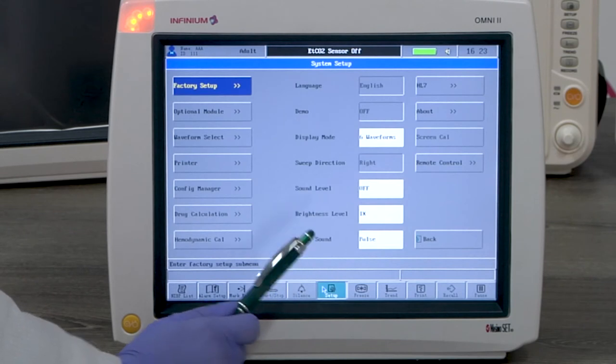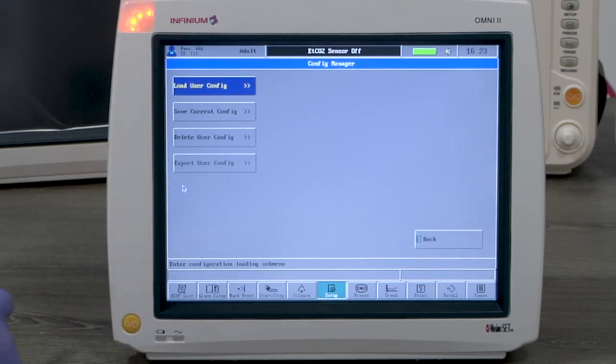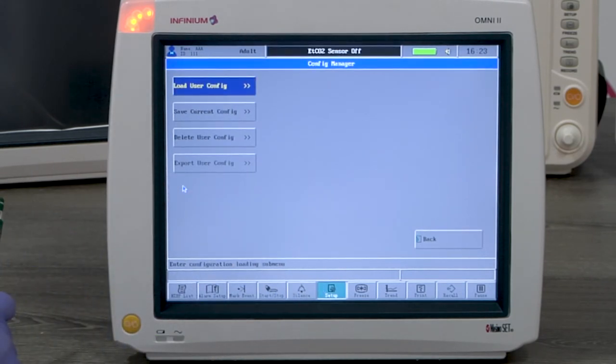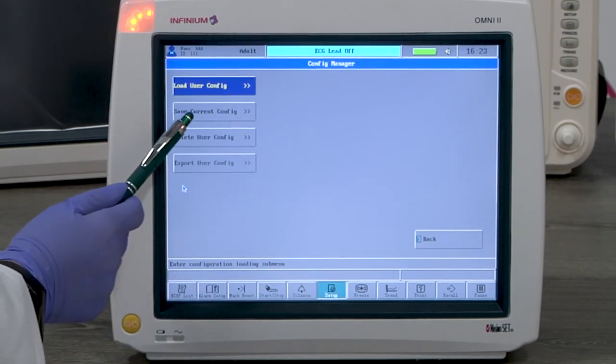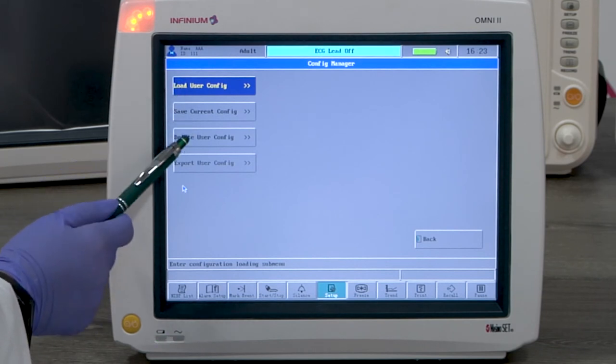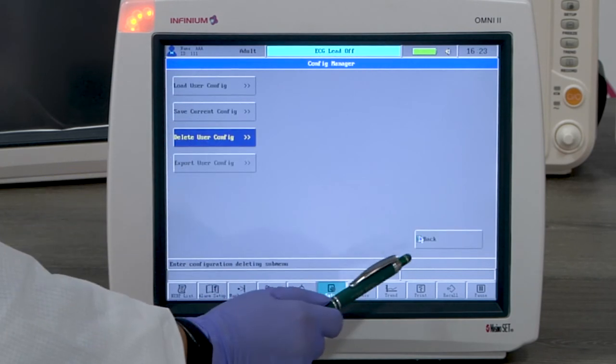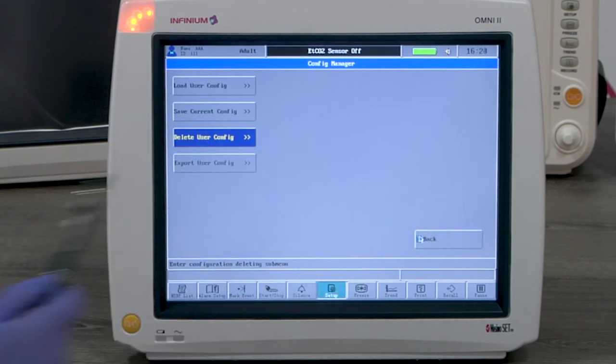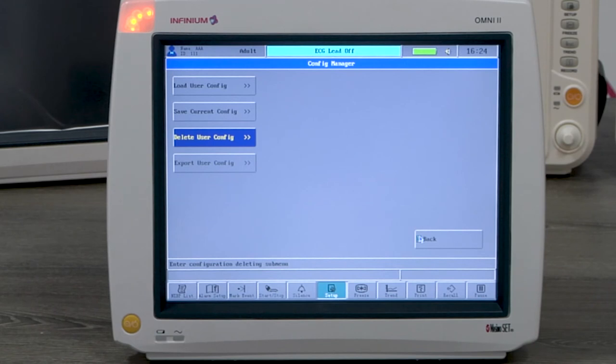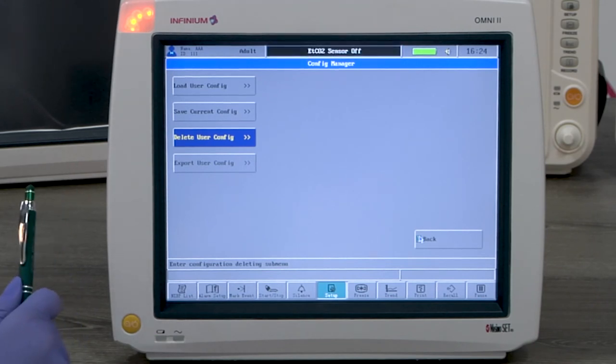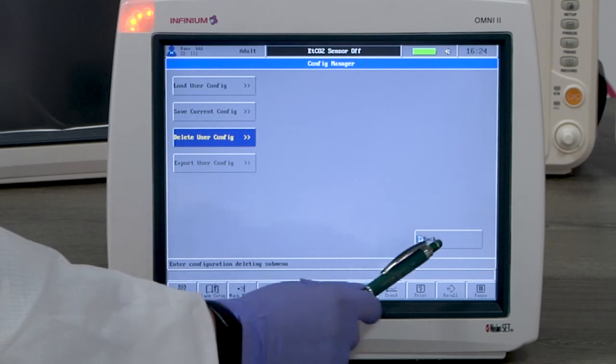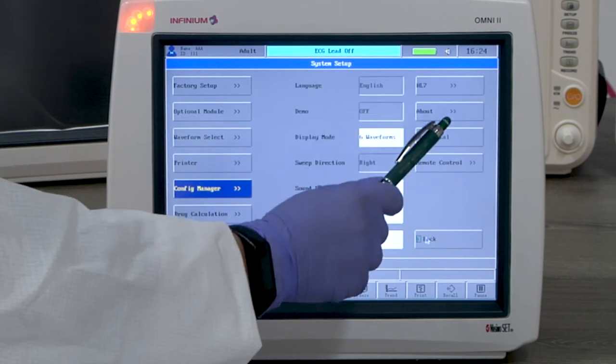Some other settings under system setup menu include config manager gives you the option to save the current configuration or load or delete a saved configuration. This is convenient when there are multiple users using the same monitor. They can set configurations to their own preference.